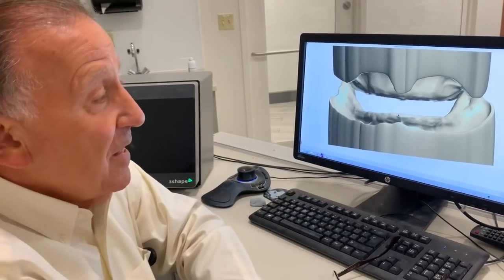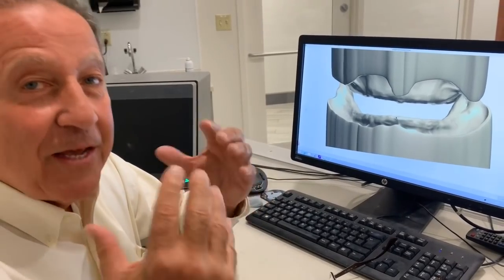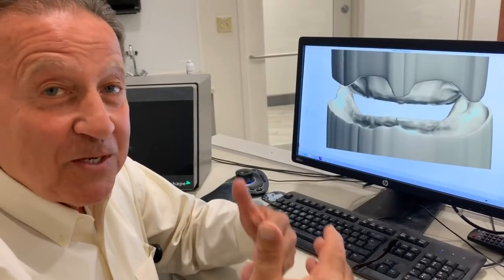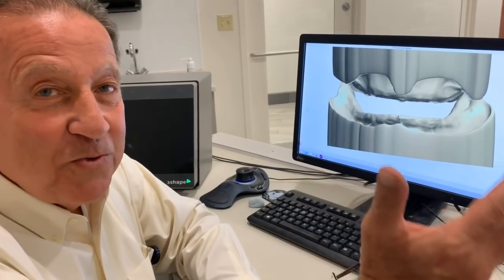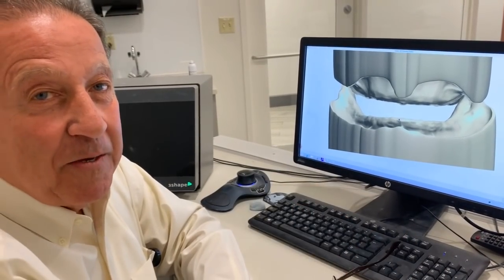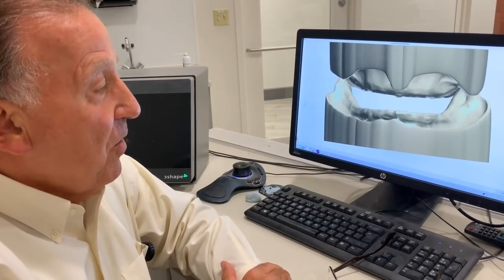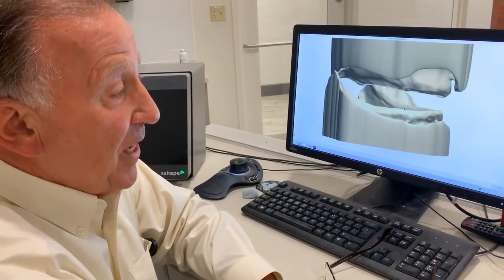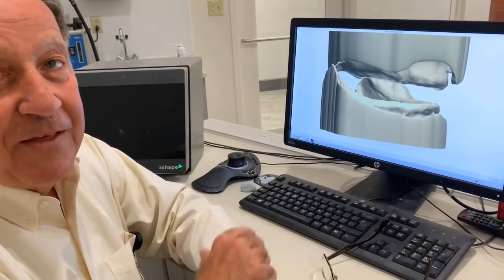That I think is a huge psychological benefit, and you tell me, knowing that, if you finally get to a point where you like the way you look, you like the teeth and everything else, God forbid something happens. But now knowing that, God forbid something did happen, you have a backup, no matter what part of the world you're in. The file is saved electronically, and you could always go back to that memory and retrieve that information and give you exactly the same teeth in the same position and have you the same look that you just had.